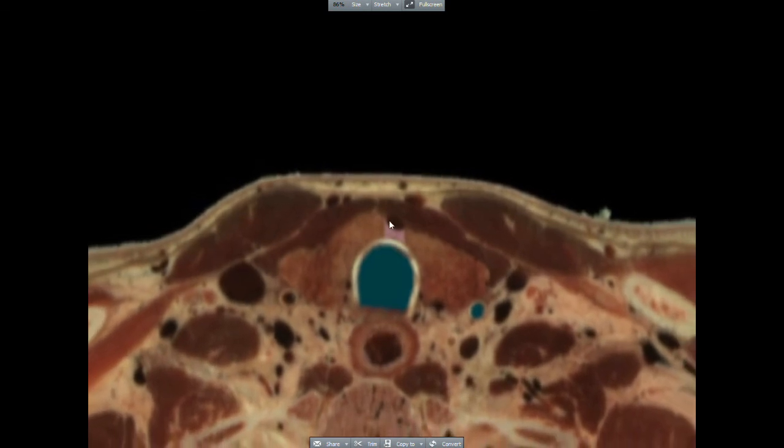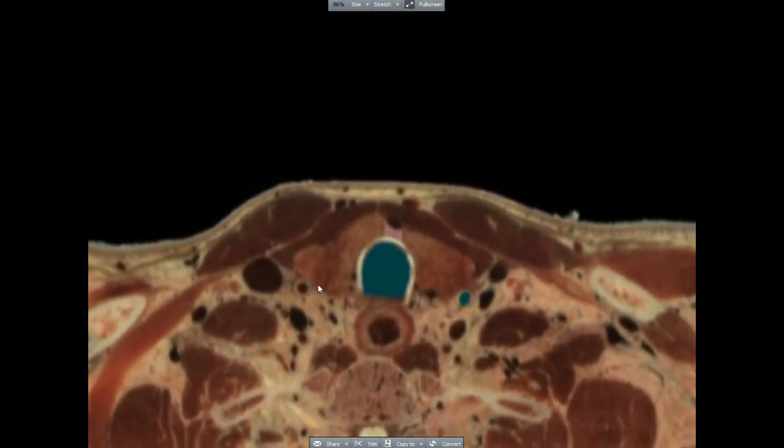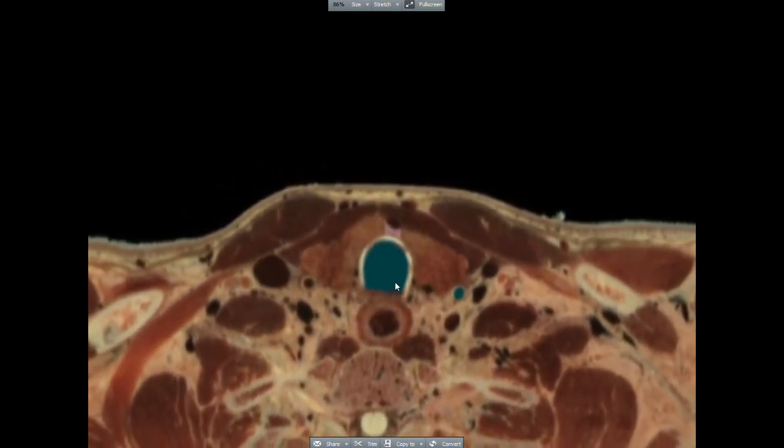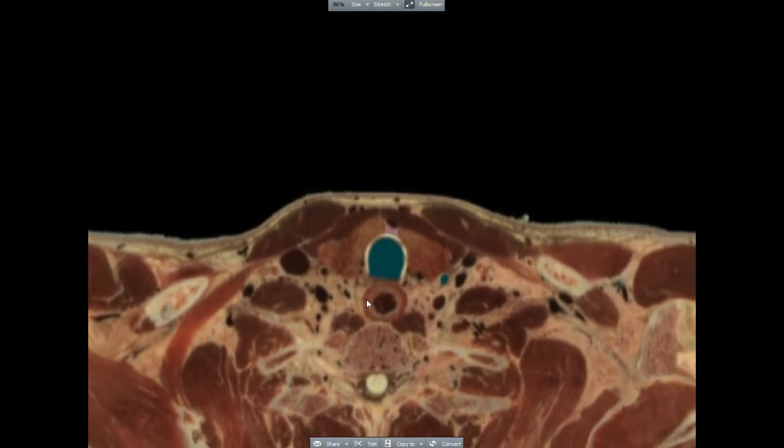Here, the final VH Dissector image shows the relationships of the trachea to the esophagus, left and right lobes. Thank you very much.